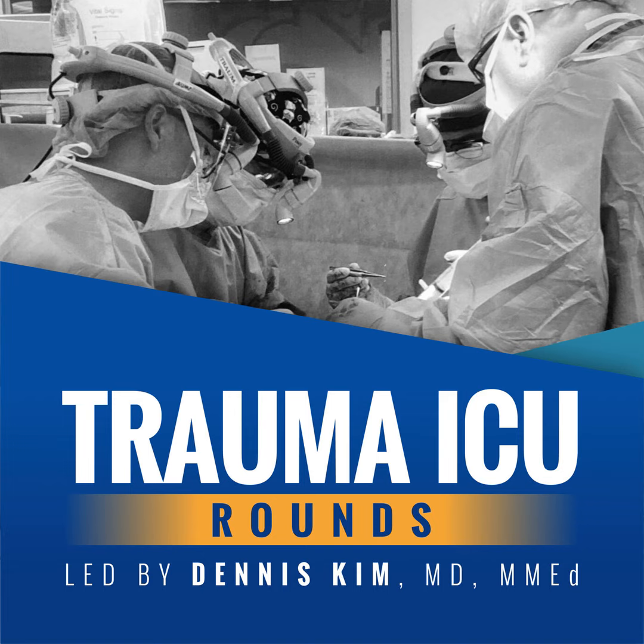Although the decision to choose volume or pressure as the control variable may vary based on whether we wish to provide a consistent minute ventilation versus limit pressure delivery, volume-targeted ventilation is by far the most common targeted control variable due to its ease of use and graspable conceptual framework. With that said, in order to understand volume ventilation, all you have to do is recall what determines minute ventilation, and that is the tidal volume times the respiratory rate.